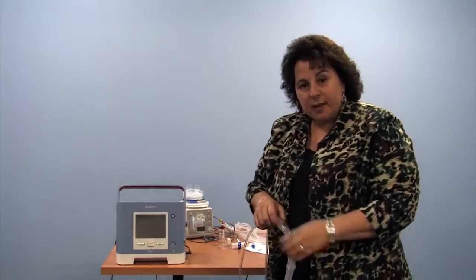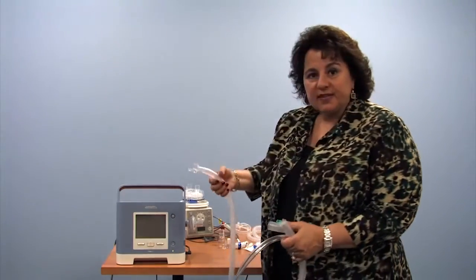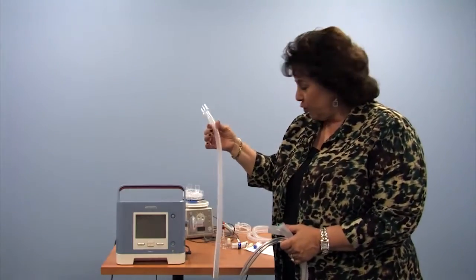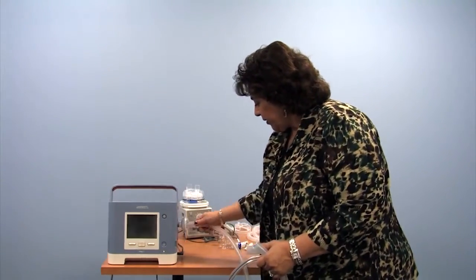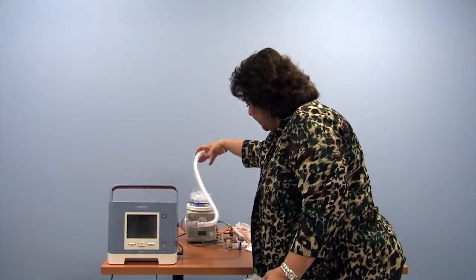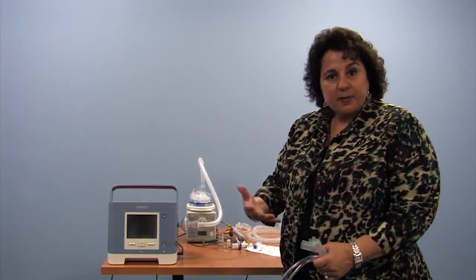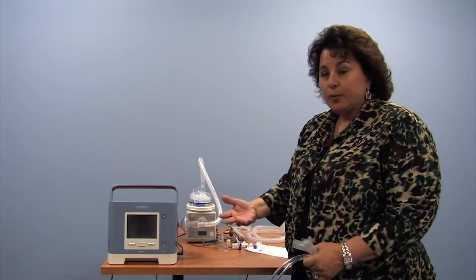The ventilator circuits come with heated wires to minimize water rainout in the tubing and maximize smooth airflow delivery to the children, and some come without. They have many different circuits, pediatric and adult size. For the purpose of this demonstration, we have a pediatric tubing that we're going to take the air from the machine and put it through a humidification system. This one we're using today is the Fisher-Paykel humidification system. There are many on the market, so it depends what your durable medical equipment company would provide for you.